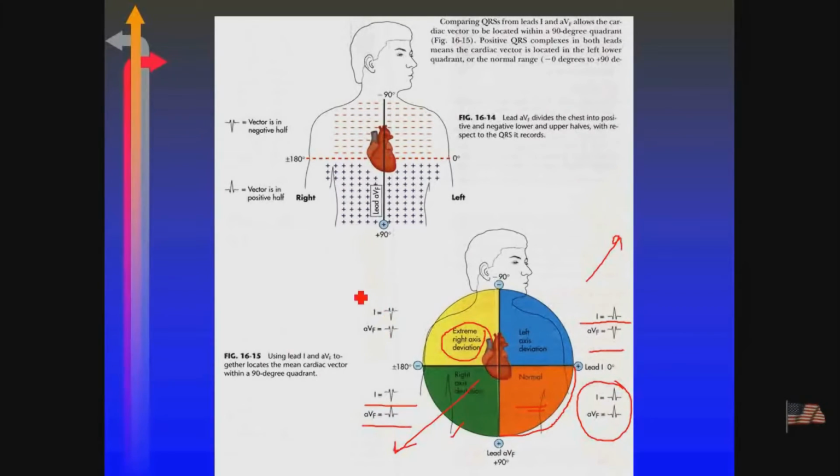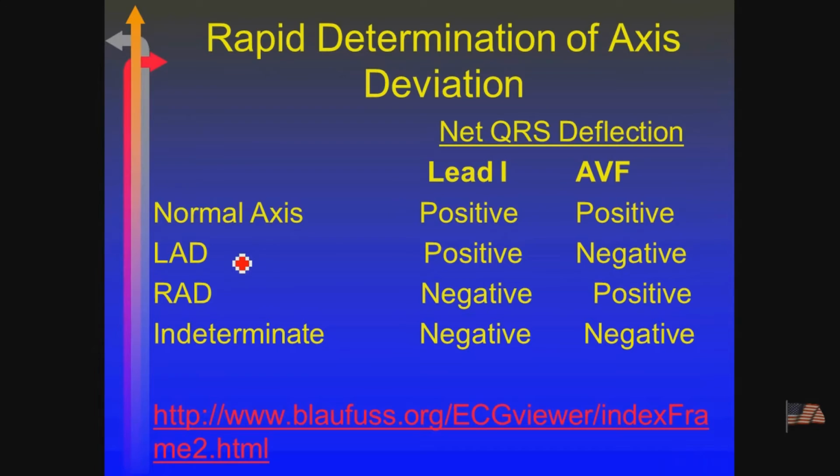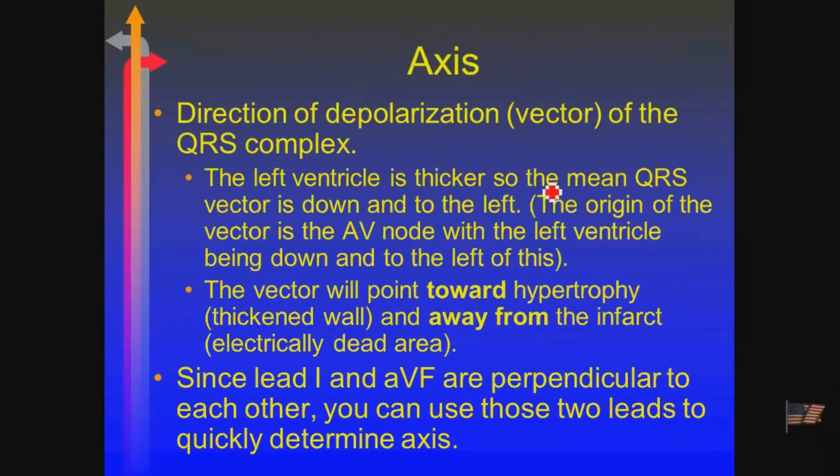So again, here's that slide a little bit bigger so you can see, just looking at lead 1 and aVF. So again, then we're talking about why we have this happening.